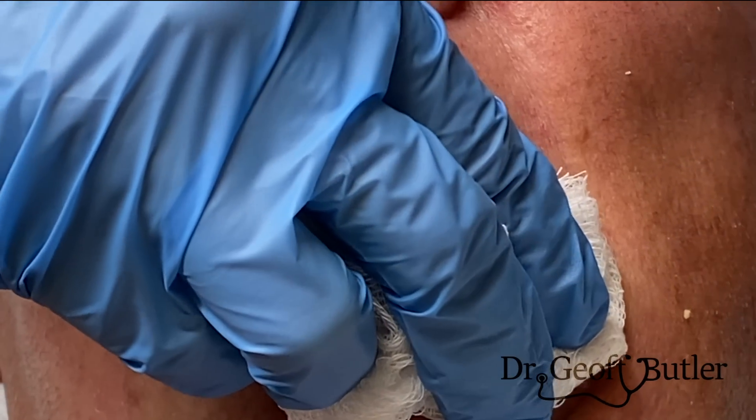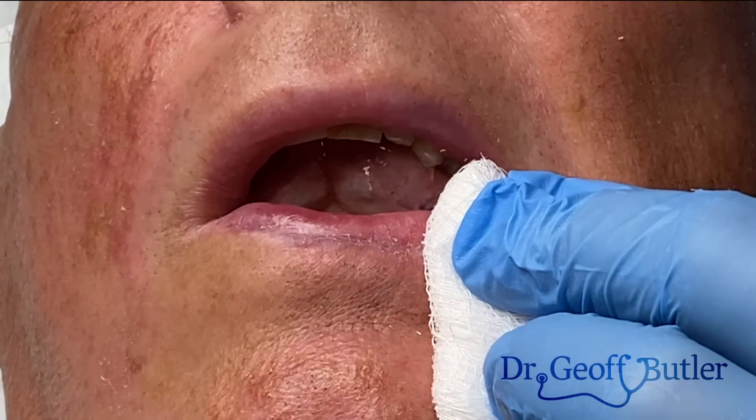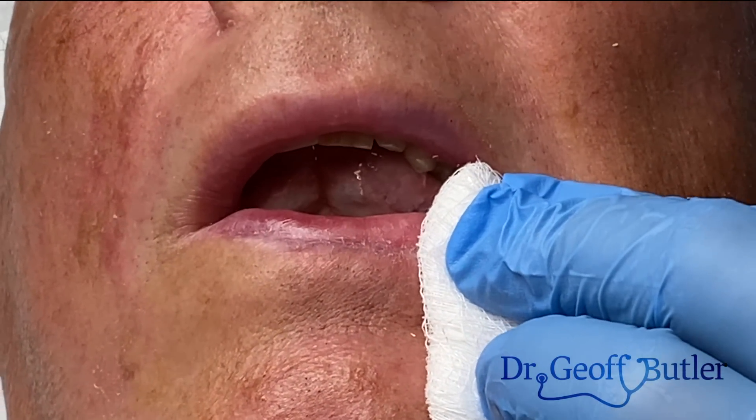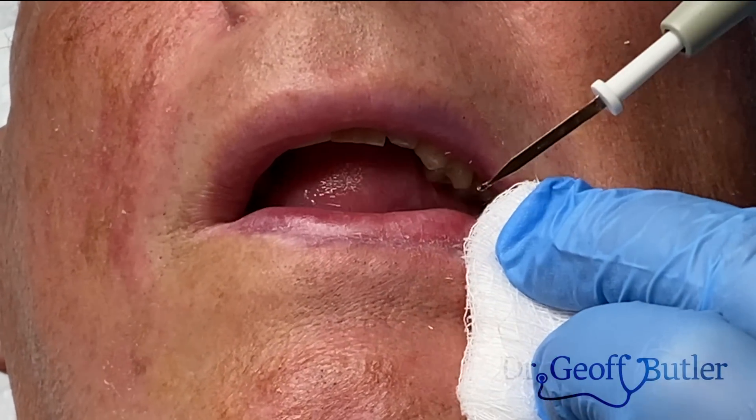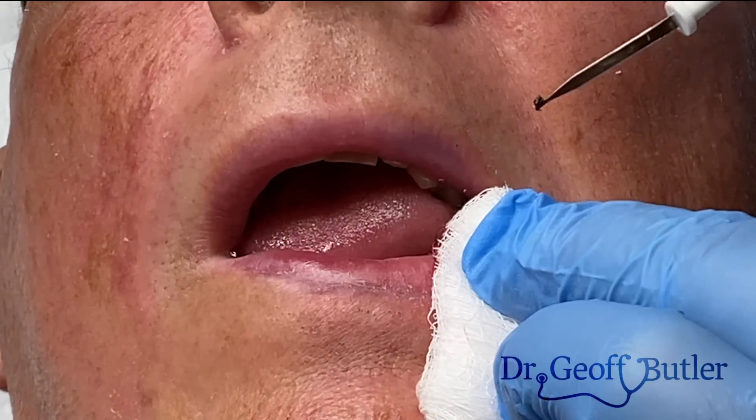Cauterizing this will obviously be a bigger challenge because it has a big blood supply. What you have to do in these cases is put a lot of pressure. This is our hyfrecator that sends a current down. Then just as soon as I lift up on it even just a little bit, I want to be cauterizing.